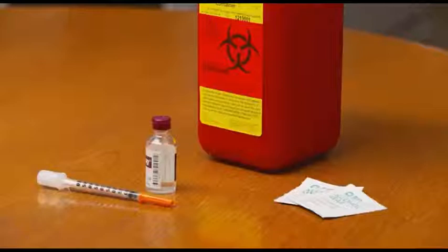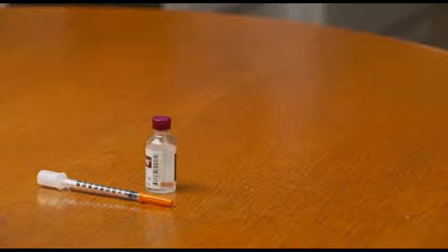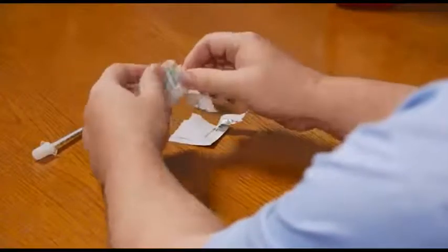First, gather all your supplies onto a flat surface. You'll need your syringe, a bottle of insulin, 2 alcohol swabs, and a sharps container. After washing your hands with soap and water, open the alcohol swabs and place them on top of the packages.